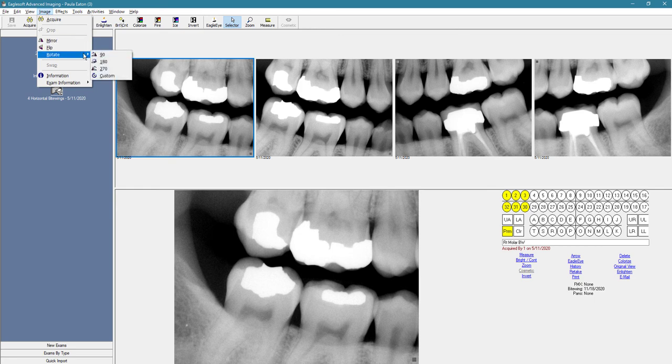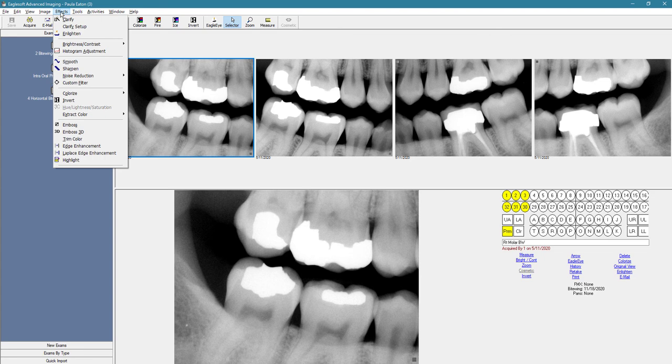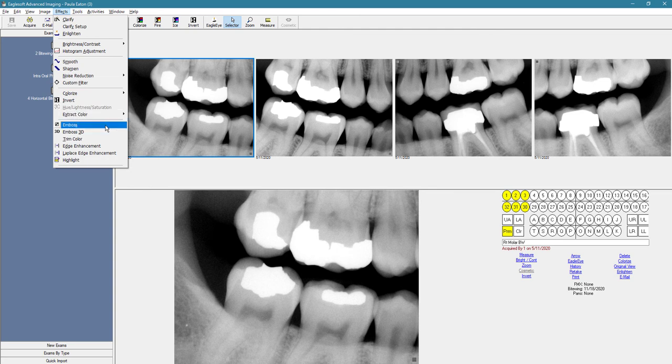Under effects, you can colorize. You can invert and emboss to facilitate diagnosis.